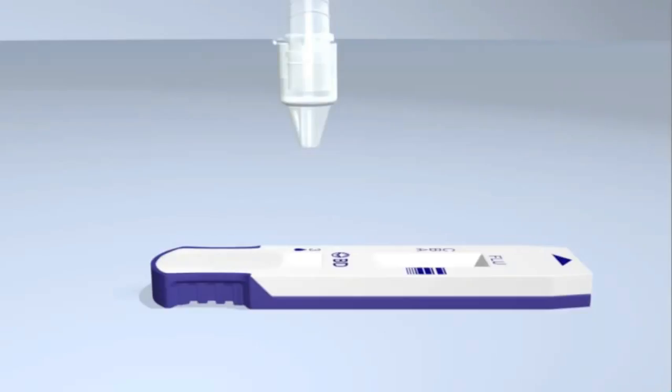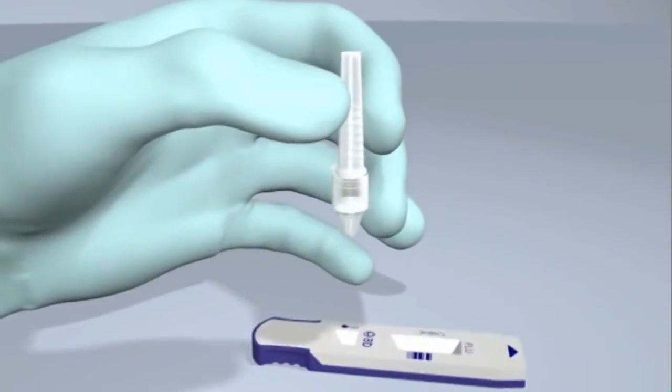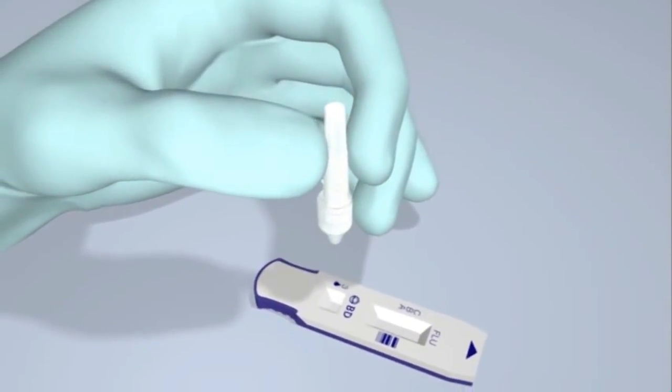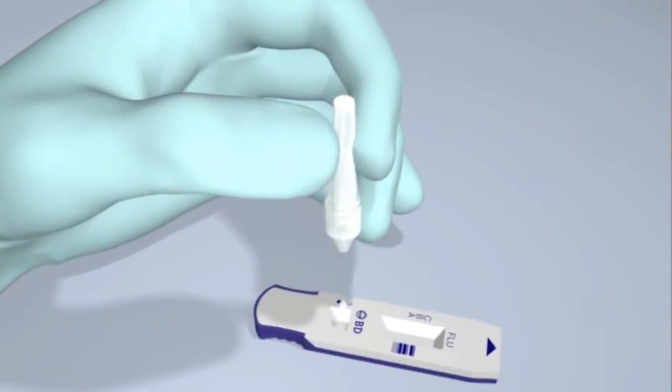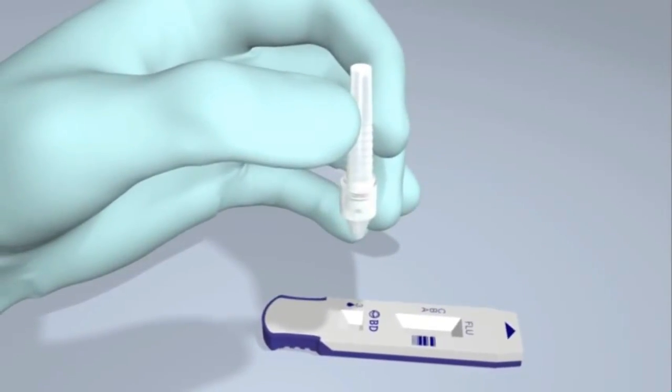Invert the tube and hold it vertically, approximately 1 inch above the sample well of the test device. The sample well is the small well next to the teardrop mark. Squeeze gently on the half of the tube furthest away from the tip, dispensing 3 drops of the specimen into the sample well of the properly labeled Flu A plus B test device.